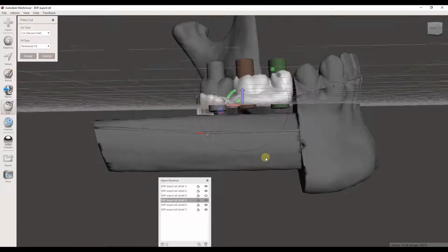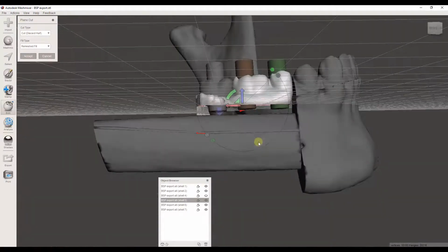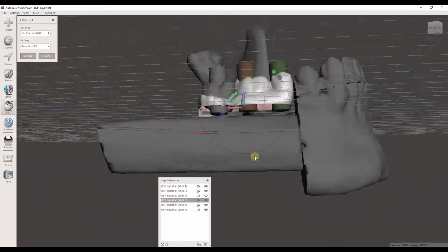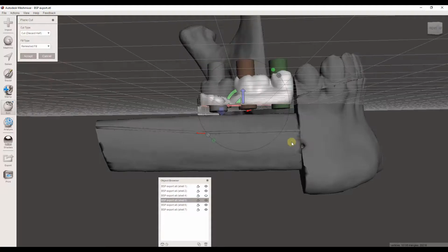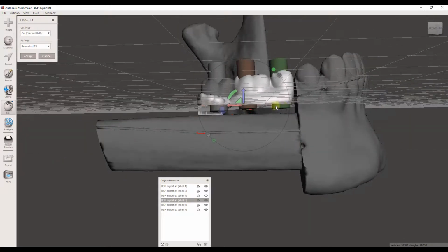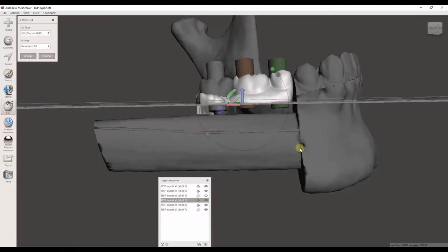Now, as a general rule, you want to have these abutments sticking down a little bit, because with this certain abutment we planned with, the bottom of these cylinders are positioned where the little feet of the temporary cylinders are going to be positioned.